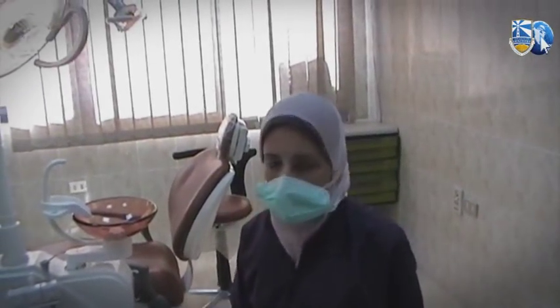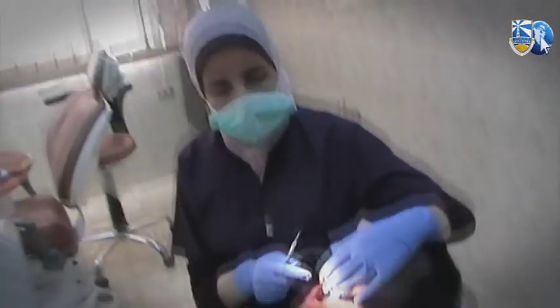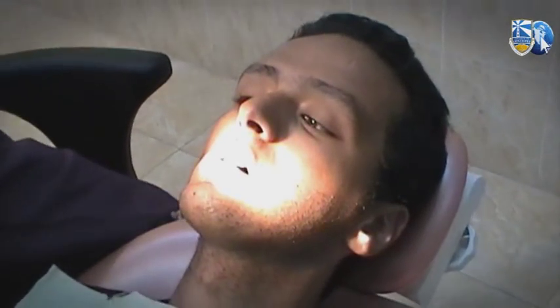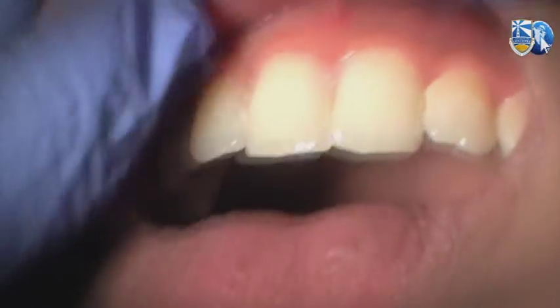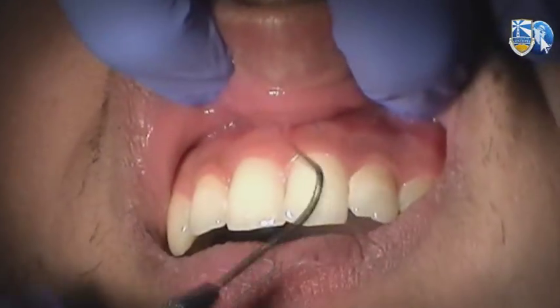The next item is texture — the surface of the gingiva. The normal surface will have stippling. It's not smooth; it has stippling, or an orange peel appearance. This orange peel appearance is normal and is due, histologically, to the fibrous structure of the gingiva. To see this stippling, I have to dry the gingiva with cotton or gauze and then examine it. You see this orange peel appearance? This is not a smooth area.